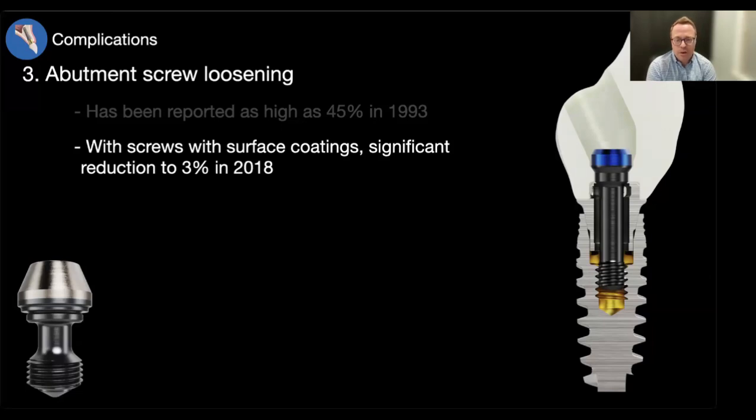So when you actually torque the abutment screw, you're actually transferring more of that torque to the whole complex and actually getting a much better what we call preload, which means you're actually stretching the screw a little bit, which helps clamp the components together. And that's something that when you torque something to, let's say, 35 Newton centimeters, you lose a lot of that torque into the friction of the head of the screw as well as the threads that are down inside the implant. So this helps reduce that. And that's what really has helped reduce the amount of screw loosening.